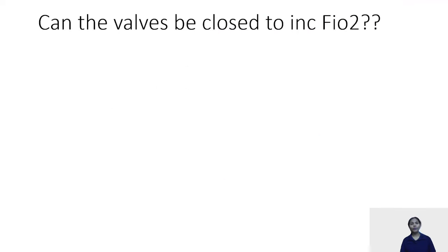Next we come to a very favorite question of everyone to ask. If you have ever seen a face mask, all face masks have certain ports on their sides. What are these ports meant for? Yes, these ports are generally meant for exhalation of the expired gases.